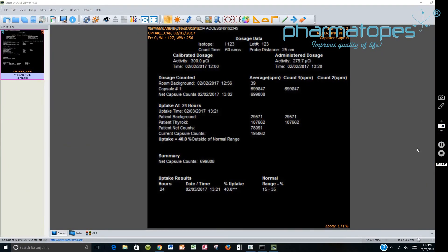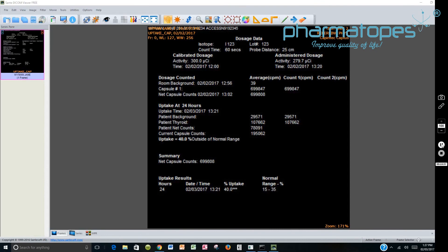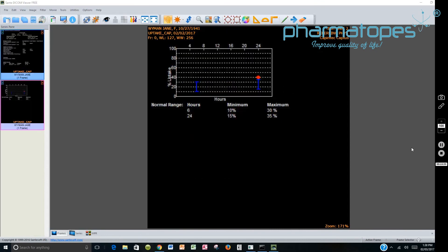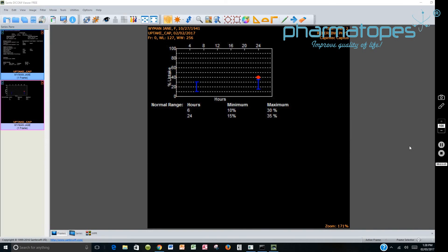You should then go to your DICOM reviewing station. You should be able to pull up the report on Jane Wyman. And you can look at report one. And then we will also look at report two. Report two shows the graphic display of the DICOM image. Then this concludes the module regarding the CAP DICOM setup, utilization, and display.